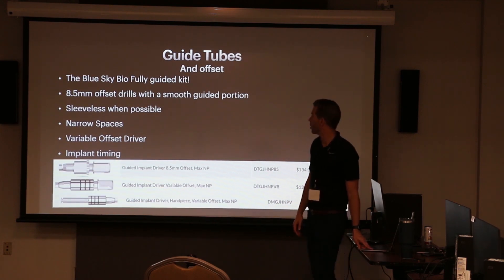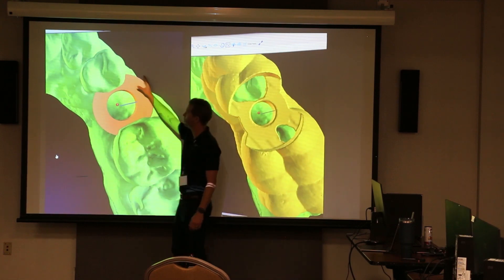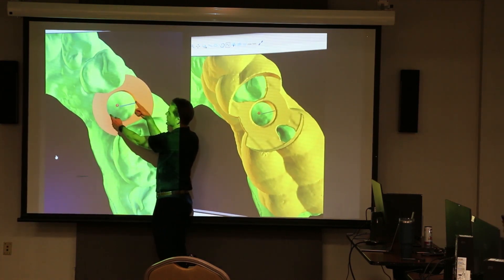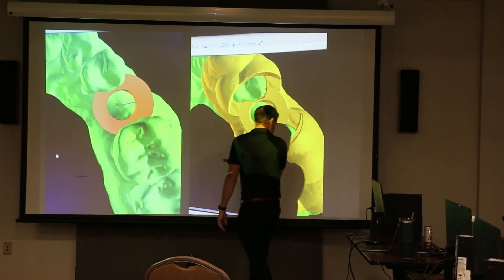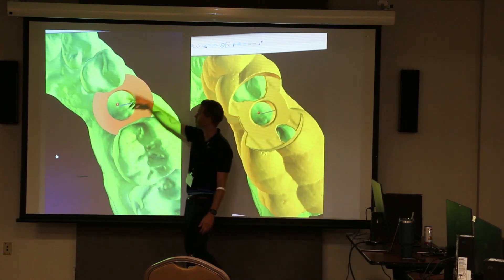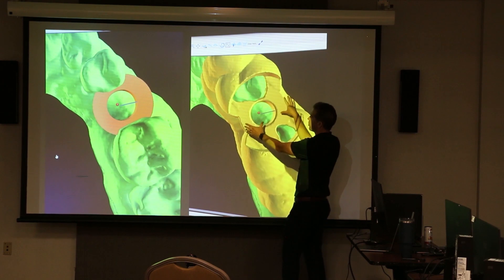A lot of fundamentals here that we've covered before, but an important concept to review: a guide tube is a digital cylinder planned around the implant. It has a set diameter and a set offset away from the implant. The software takes that guide tube and makes it part of the guide. A lot of people get confused by the outer ring versus the inner ring — you really only need to care about the inner ring, because the inner ring is what gets built into your guide and becomes part of the plastic.